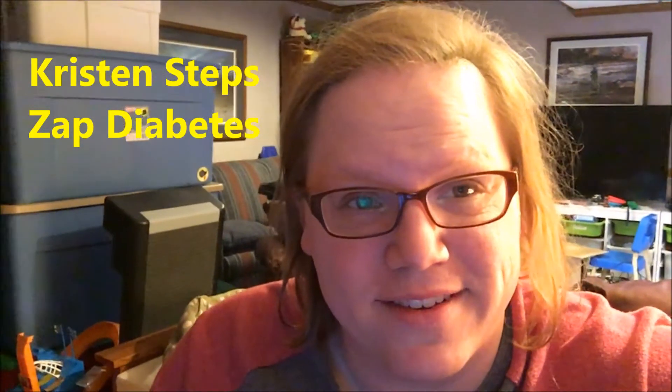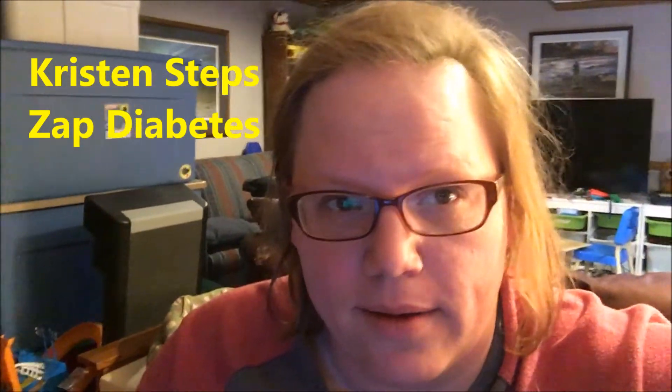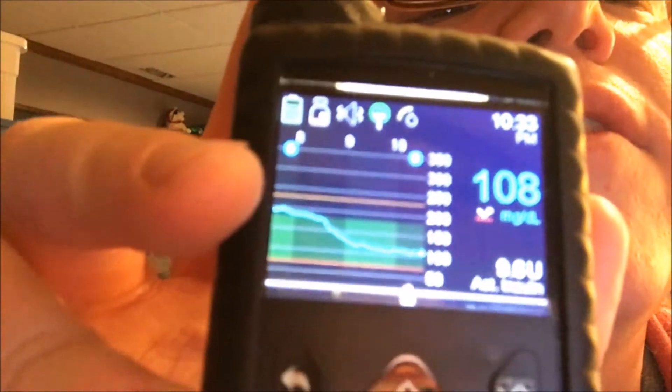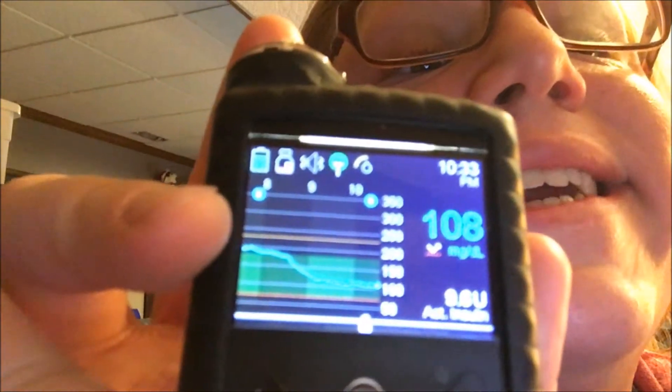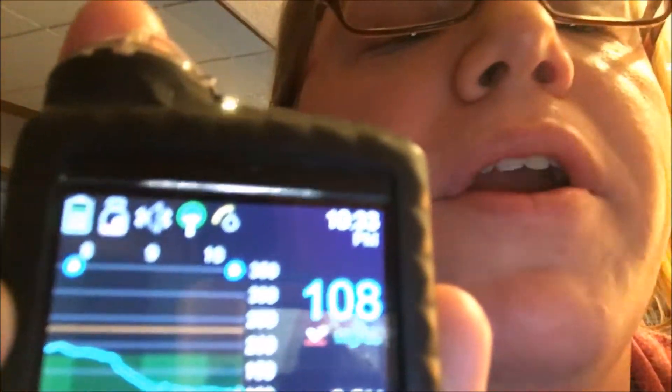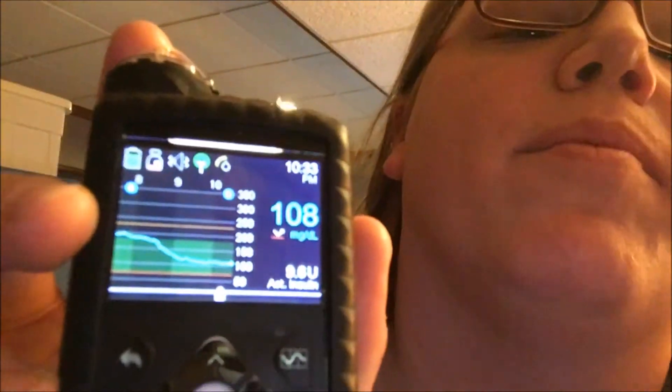Hello Zapp Diabetes! Kristen Steps here again. It's gonna be a quick one today but check this out. I have the CGM working on my 670G. It looks like because it's mirrored on my side, it looks like I'm 801 — that's not the case, I'm 108. It's probably what shows up for you. That's kind of funny.